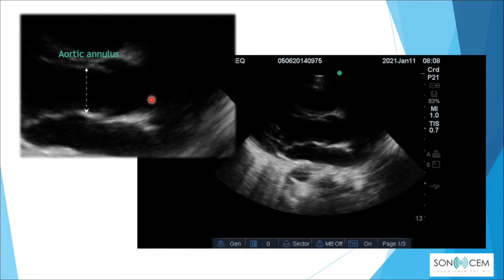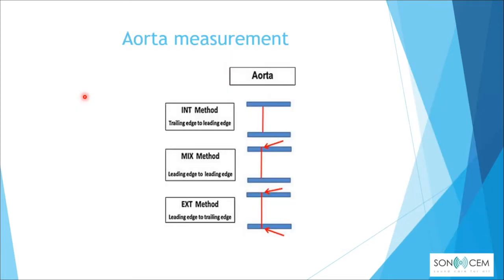At the aortic annulus, the measurement should be from inner wall to inner wall. In general, there are several methods for measuring the aorta: the mixed method (leading edge to leading edge), the external method (leading edge to trailing edge), and the internal method (trailing edge to leading edge, or inner edge to inner edge). For the abdominal aorta, the external method — outer wall to outer wall — is used.